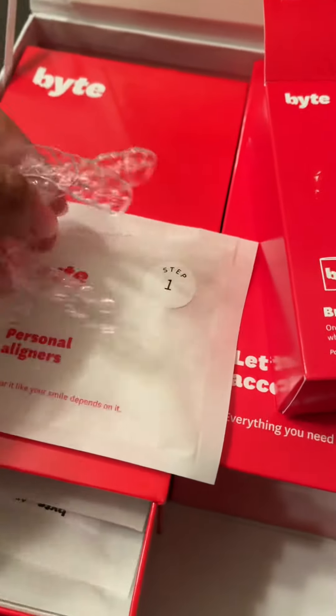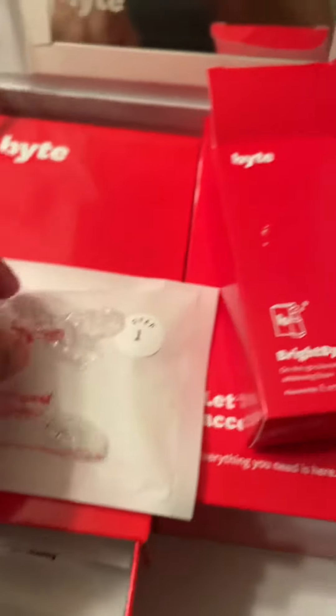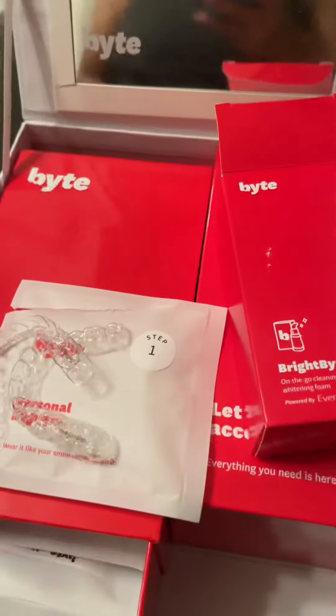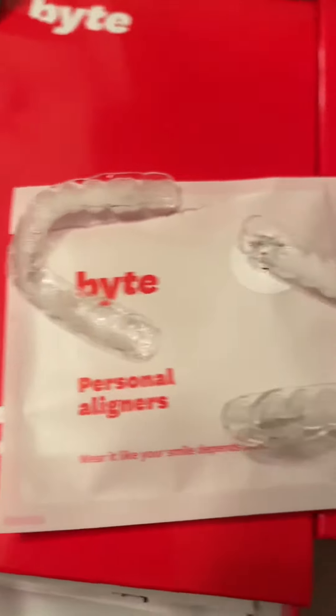I'm gonna get my step one — I open the pack, step one. I have two aligners. I'm gonna put some of my BrightBite in it and then use my HyperBite. I put my foam pump on there. They're in — they fit pretty well — and I'm going to use my HyperBite.